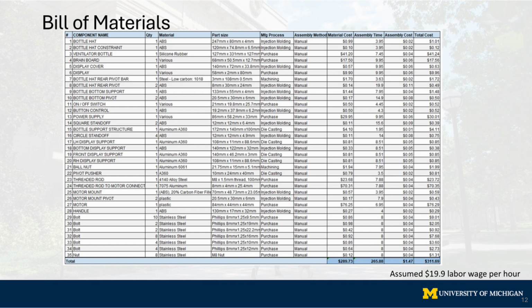Across the various components, the current design of the housing of the ventilator either requires injection molding, machining, or die casting. Other components such as the electronics, motor, and bottle are purchased off the shelf. Material costs for the machined and molded parts were selected through custompart.net, while the cost of the purchased parts are from the various vendors selected, both assuming an annual production volume of 200,000 units.